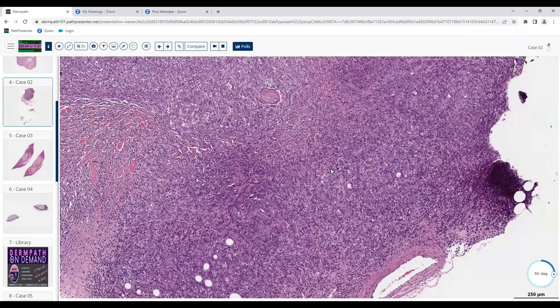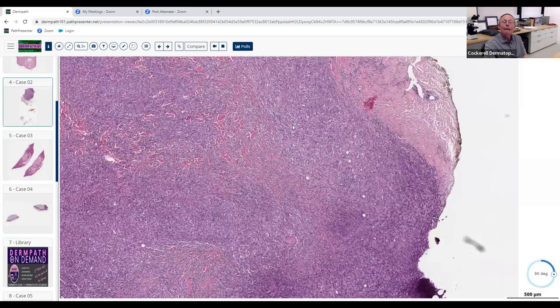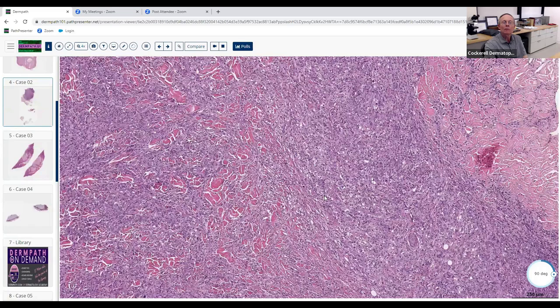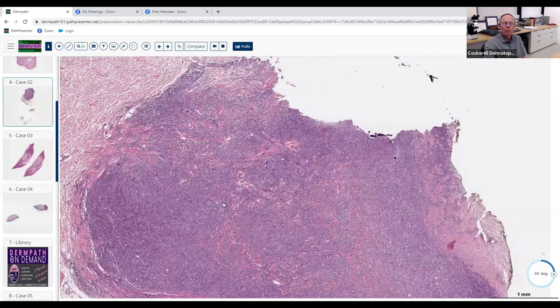CD30-positive transformation occurs in some cases of mycosis fungoides and is a harbinger of bad prognosis — usually seen in thicker plaque-like lesions, nodules, and tumors. What other important entities should you not miss? Hodgkin's lymphoma can be CD30-positive, though it rarely involves the skin. But what's the most common CD30-positive entity we see in the skin?